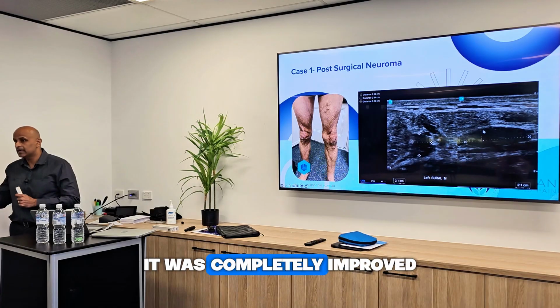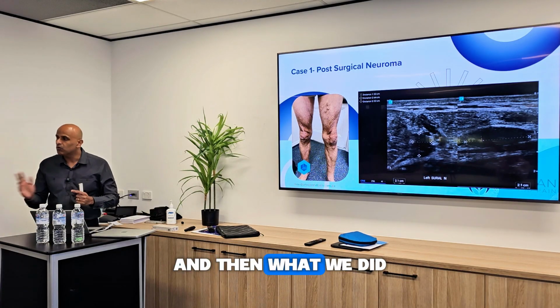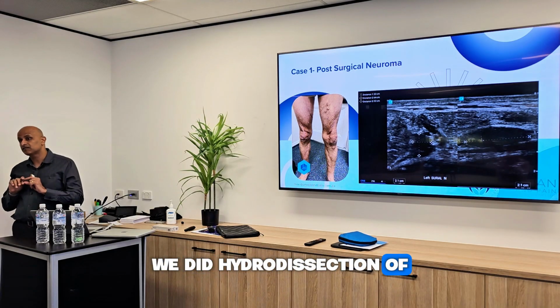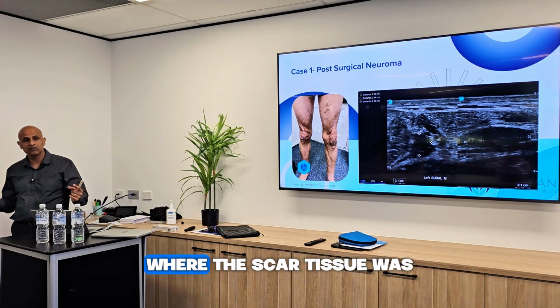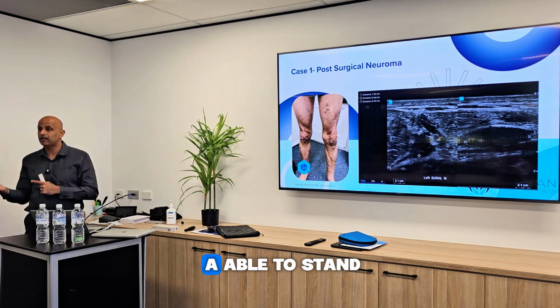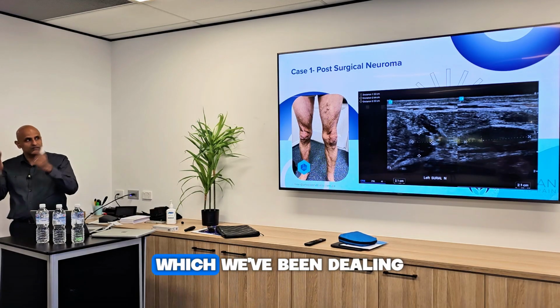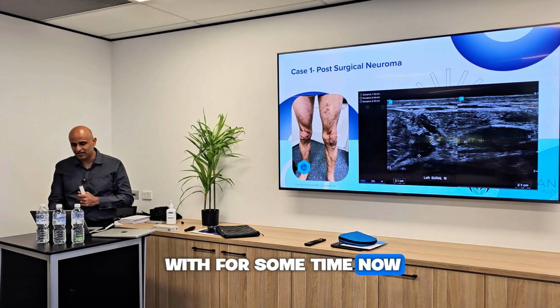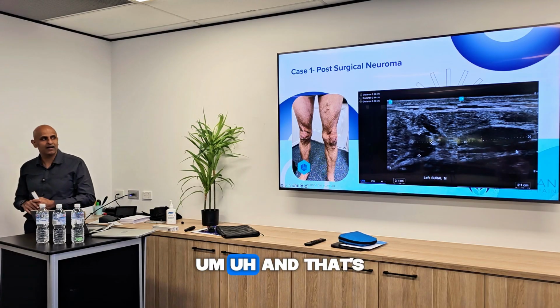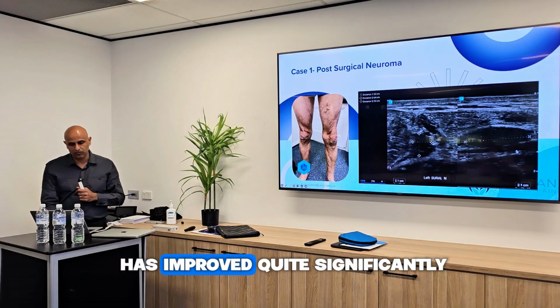He was completely improved of his neuropathic pain. And then we did hydrodissection of that tib post tendon where the scar tissue was. And he's back to being able to stand on tiptoes. He also had neuromas, which we've been dealing with for some time now, and that's slowly improving. So his quality of life has improved quite significantly.